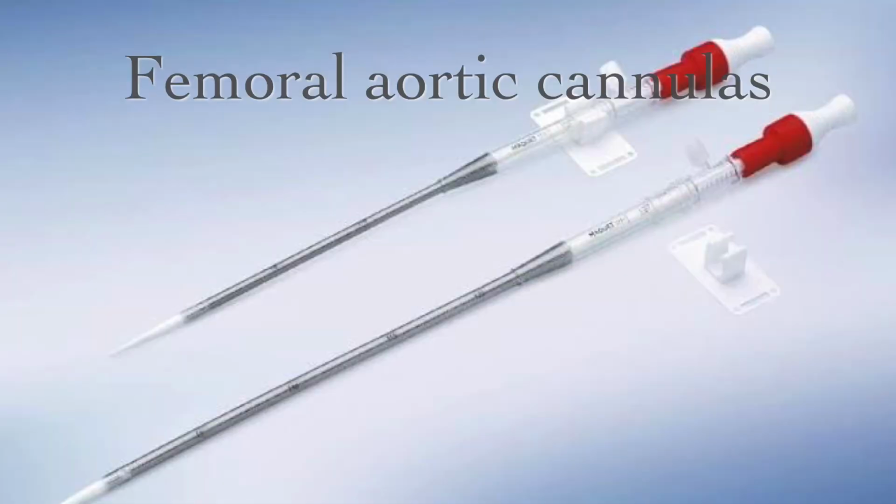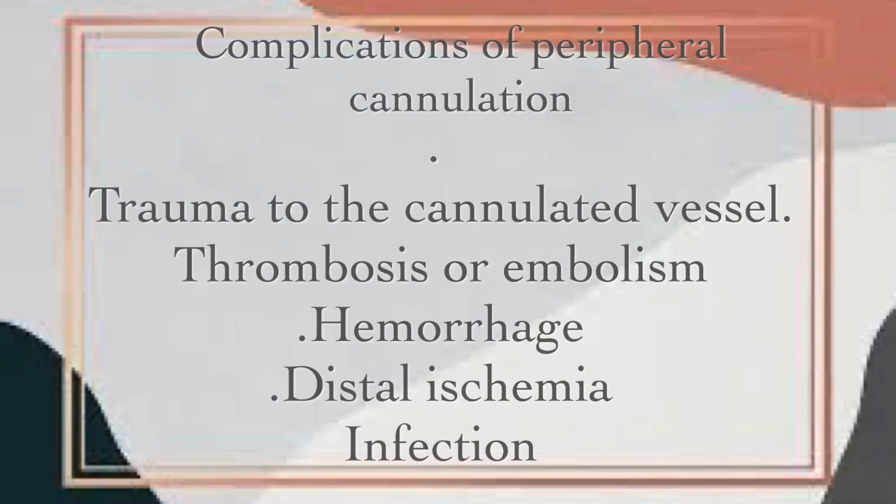Femoral aortic cannulas. Complications of peripheral cannulation: trauma to the cannulated vessel, thrombosis or embolism, hemorrhage, distal ischemia, infection.